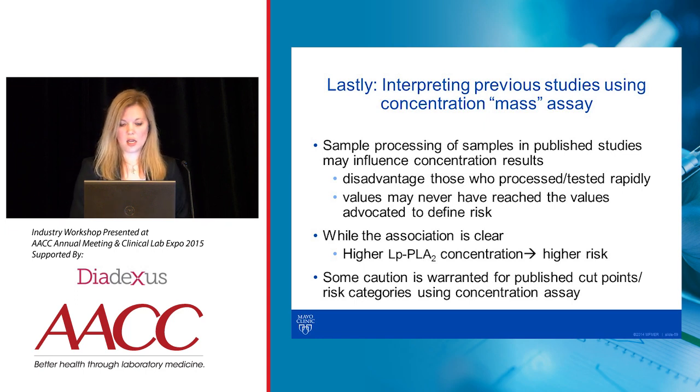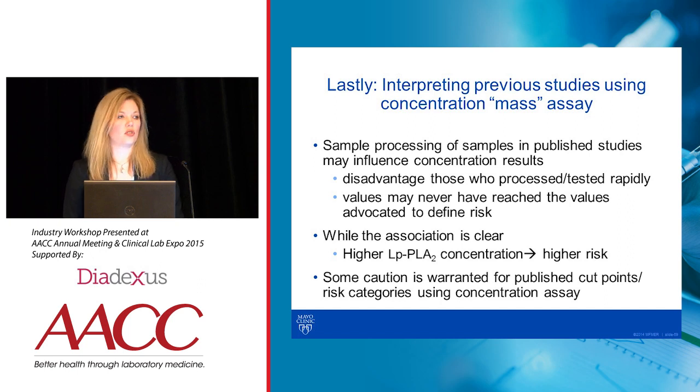sample processing. So while it's certainly clear that elevated concentrations of LPPLA2 confer higher risk in patients, definitely some caution is warranted for published cutoffs and risk categories using the concentration assay. But again, the activity assay doesn't have these limitations, and certainly it's much more analytically stable in our opinion.